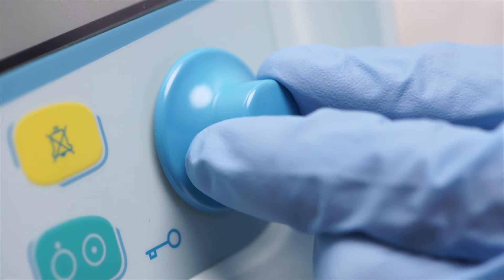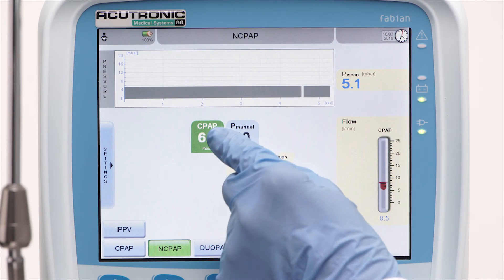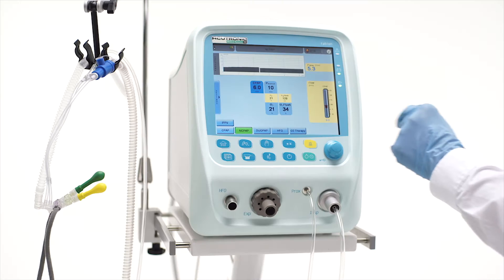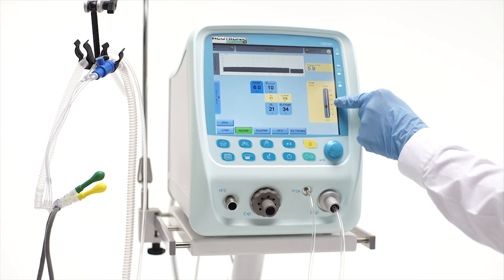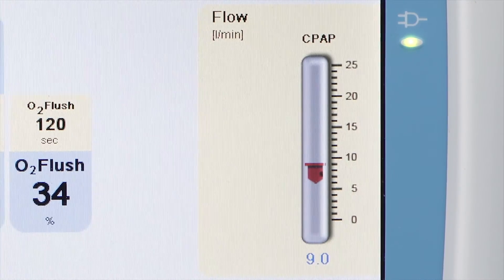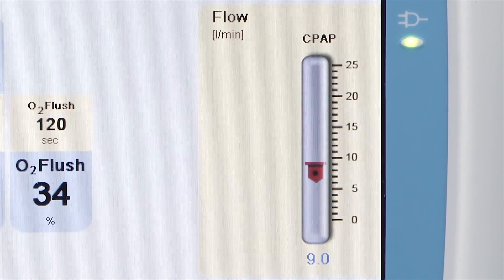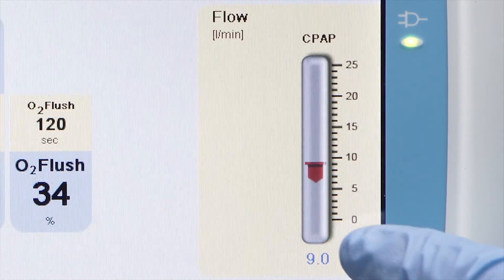Press, adjust, and confirm the setting. The ventilator will then adjust the required flow automatically and display the used flow rate.